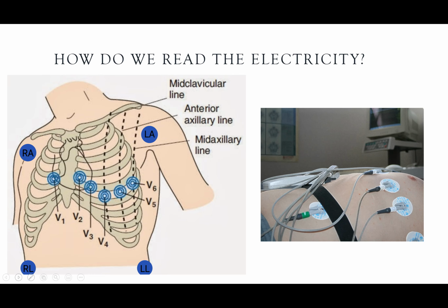So the question is then, how do we capture that electrical signal? How do we know what the electricity is doing? And we do that by putting these leads on the chest. And I'm sure many of you have probably seen this. If not clinically, you've seen it on TV, watching some kind of television show or movie.